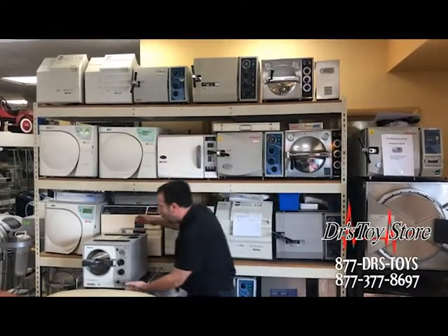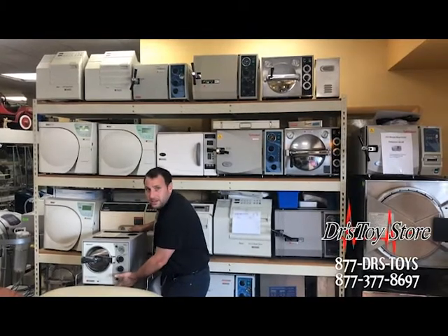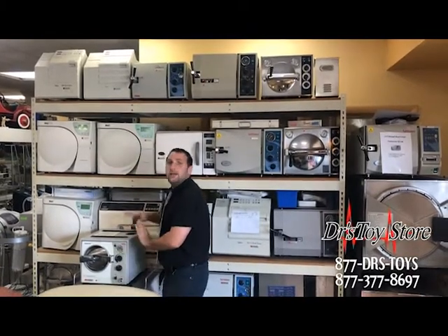We have nice small ones like these M7. This is a seven inch chamber. Quick, easy, reliable.